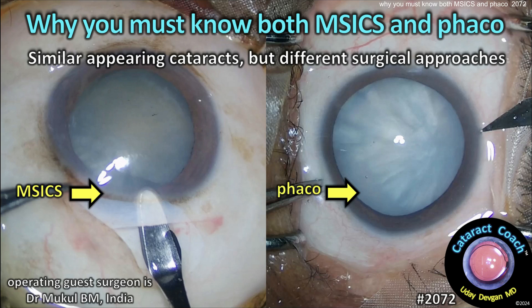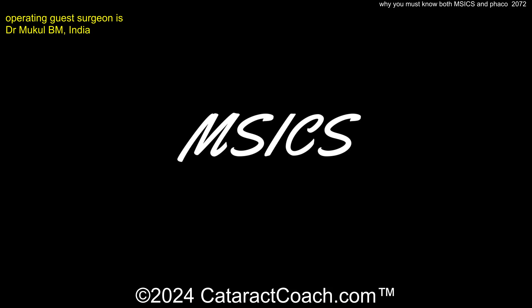Cataractcoach.com. Why you must know both MSICS and phaco: similar-appearing cataracts but different surgical approaches by the same surgeon.